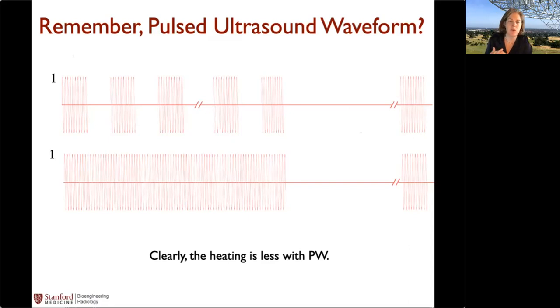Because sometimes I hear people say that if you do pulsed ultrasound, then there's not going to be as much heat as with continuous ultrasound. And I often wonder, what exactly do they mean by that? So I've set up the slide to ask this question: are we going to get the same heating with pulsed ultrasound as with continuous ultrasound?